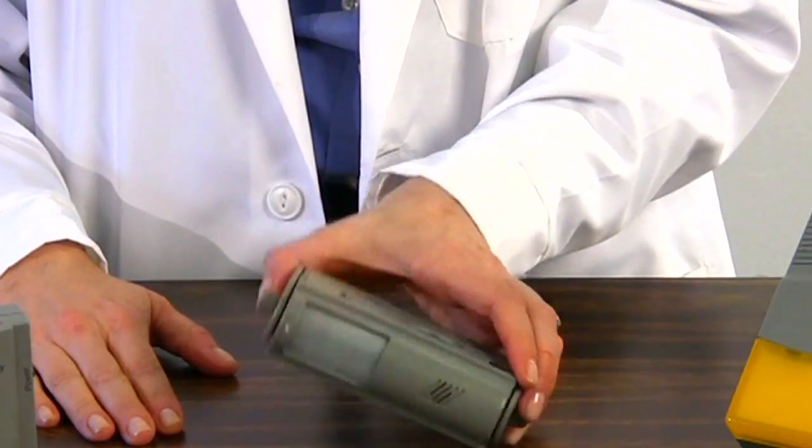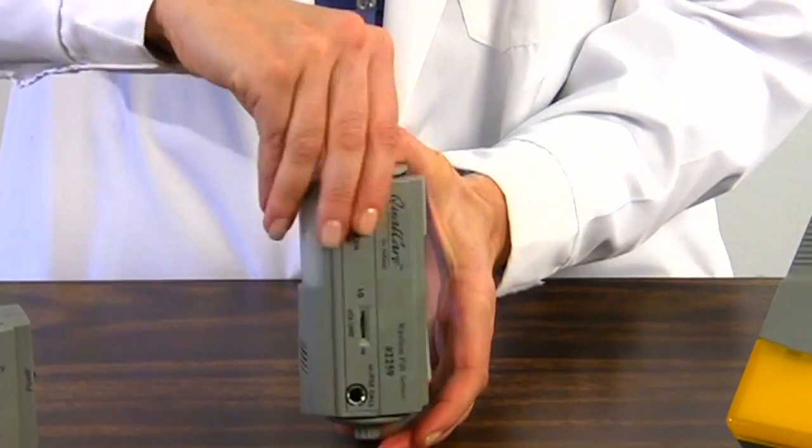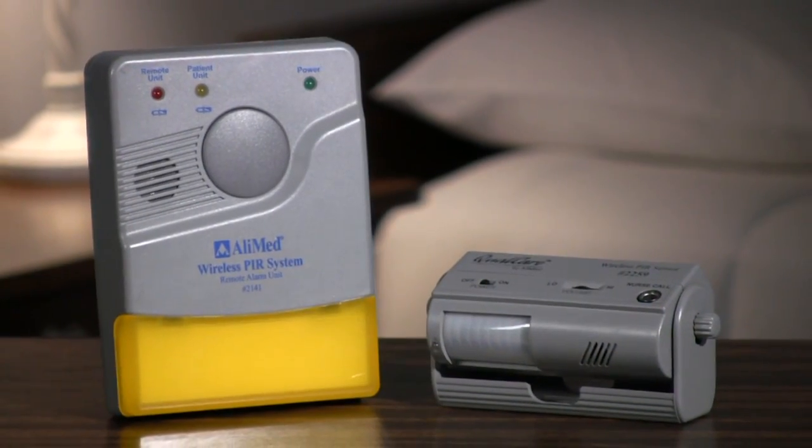Like System 1, System 3 bed alarm with remote receiver comes installed with a swivel mounting bracket and includes one 9 volt battery. It also comes with a wireless remote receiver unit.